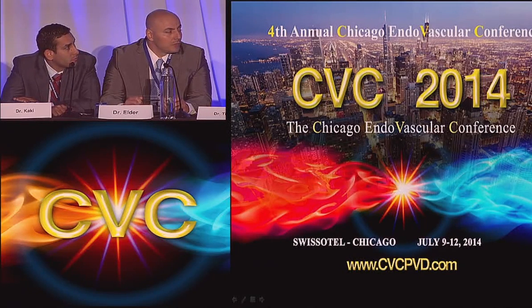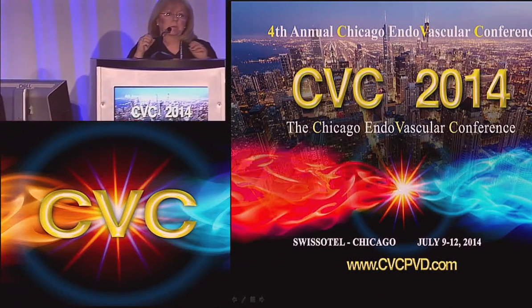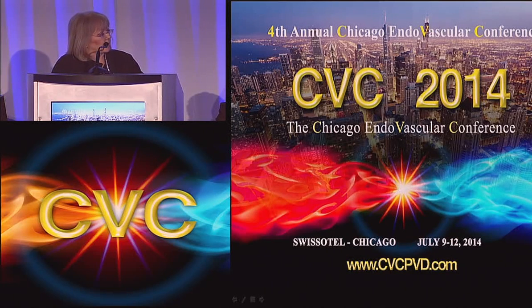Well, I think that we've had that experience of breaking up a massive obstructive embolus and fragmenting it, and it starts the process of perfusion. So it does make a huge difference just to break it up. Would anyone else like to add anything?